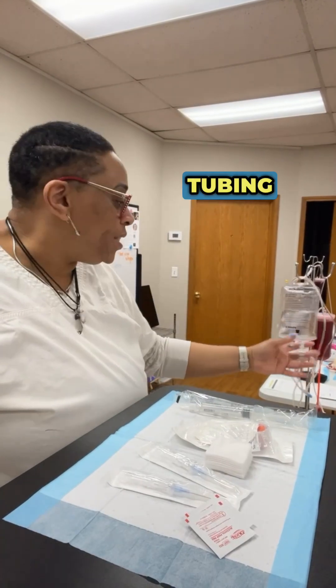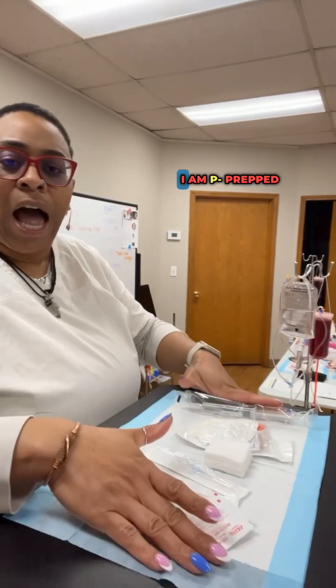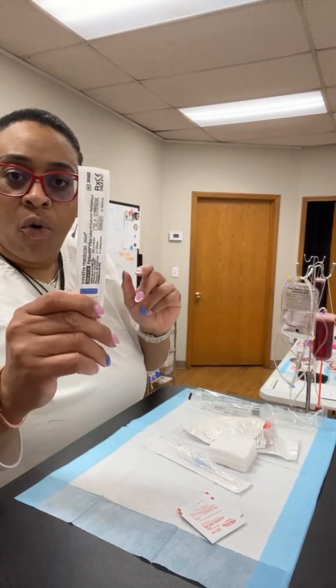Now we have our IV tubing set up. It's ready to go. All the air is cleared out of the line. I am prepped and set up and ready to go to start an IV on my patient.